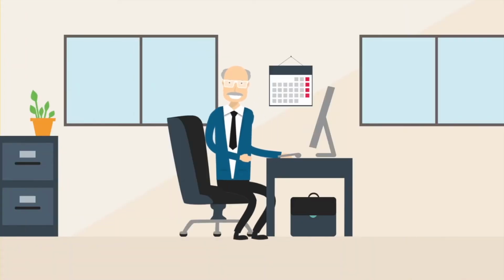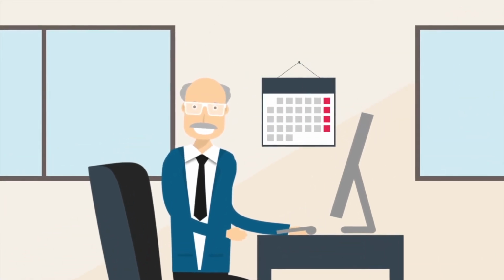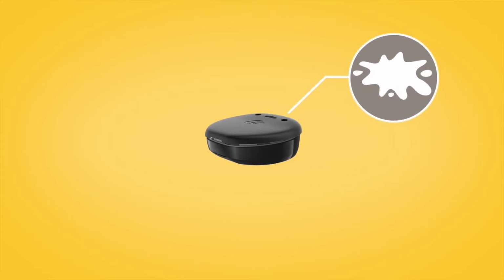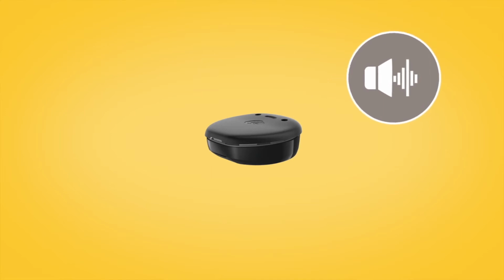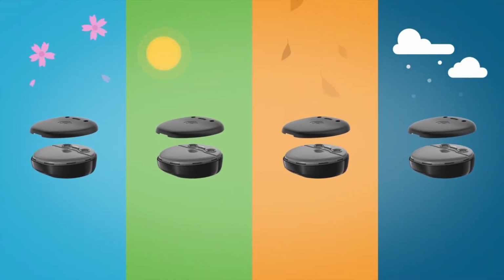You should replace the microphone cover on your Kanso 2 sound processor every 3 months, or sooner if the microphone protectors look dirty or you notice a reduction in sound quality. One way to remember this is to change every season.